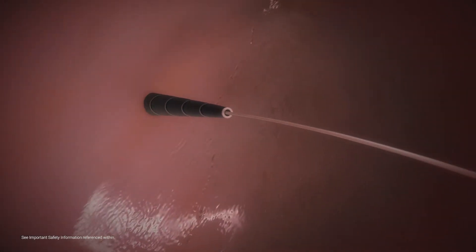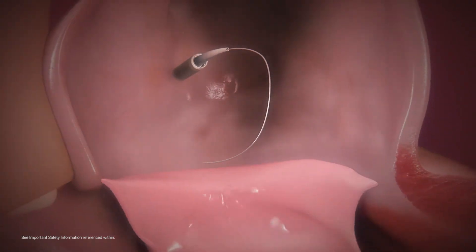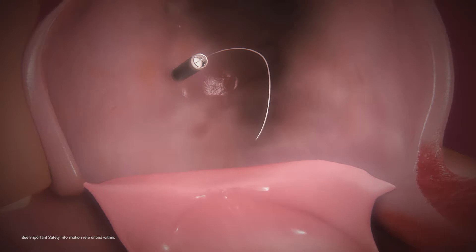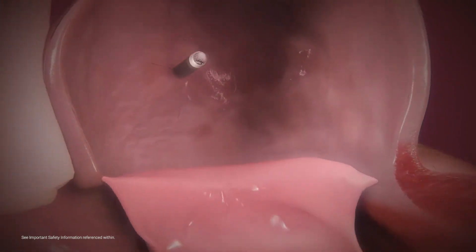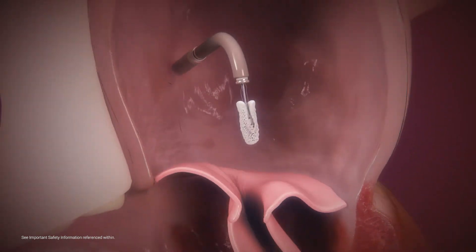MitraClip's steerable guide catheter is introduced over a previously placed guide wire. The dilator is used to gradually advance the guide into the left atrium, and the dilator and guide wire are removed. The clip delivery system is advanced into the left atrium, positioning the clip above the regurgitant jet and perpendicular to the mitral valve plane.